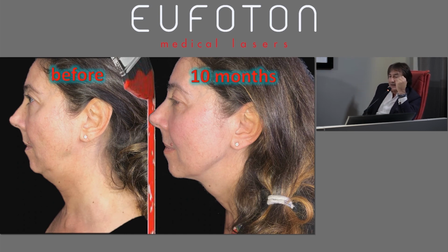Barcode wrinkles at rest: filling using the filler. Mimic wrinkles, the structures: total deep volumization. Any use of fractional or fiber laser must be done before all this, as I said.